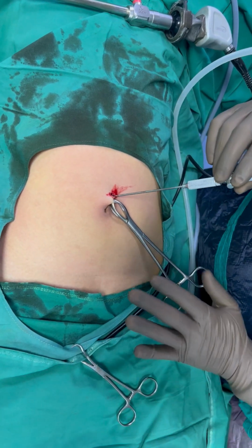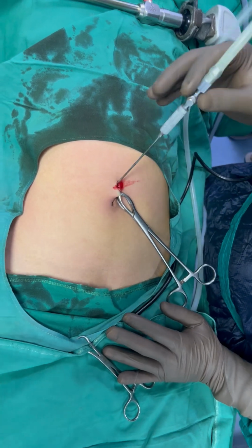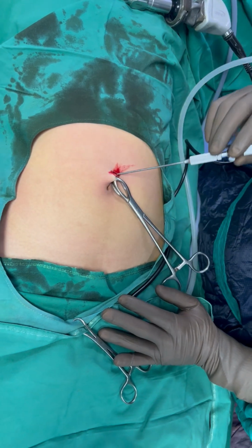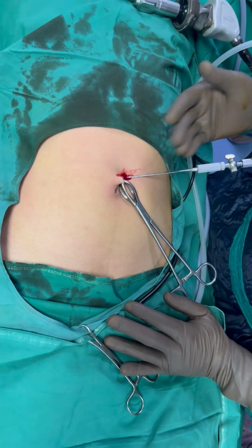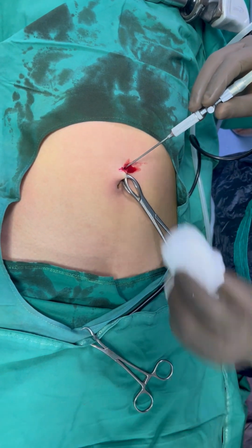the peritoneal cavity, because the abdominal wall will act as a fulcrum and the tip and body of the Veress needle will move on that fulcrum. That is a good test to see the position of the Veress needle in the abdominal cavity.